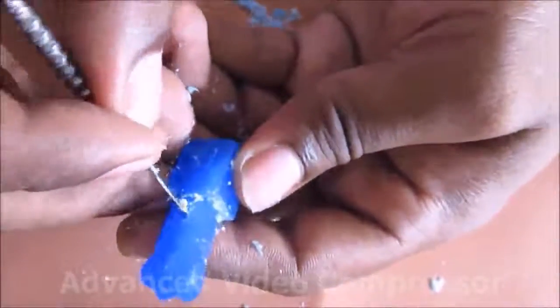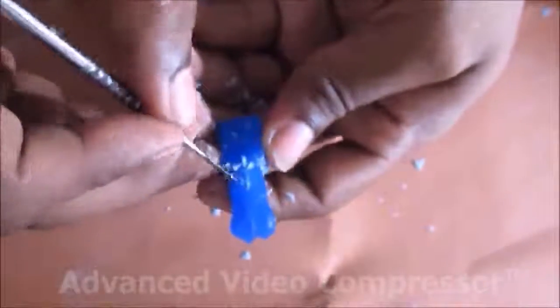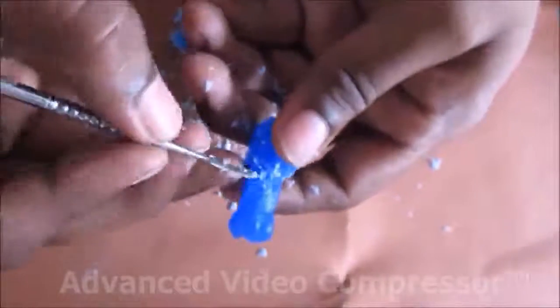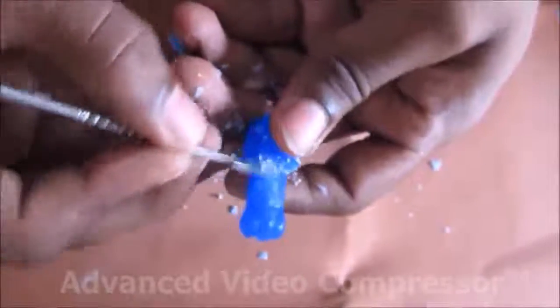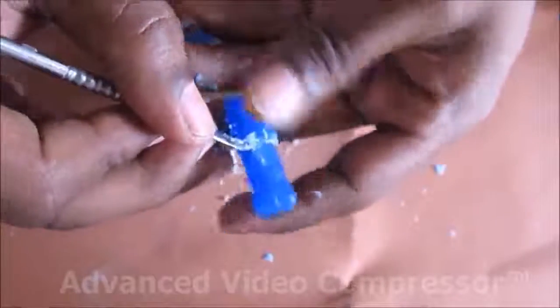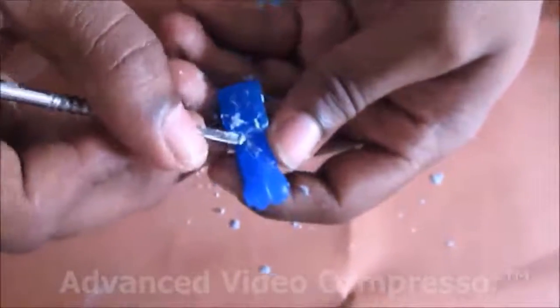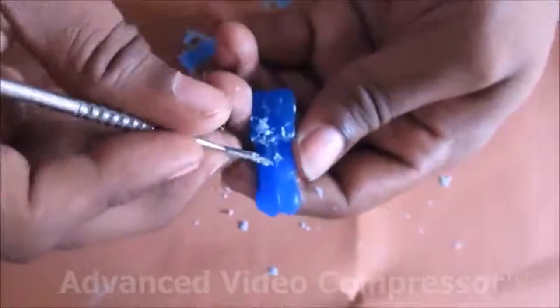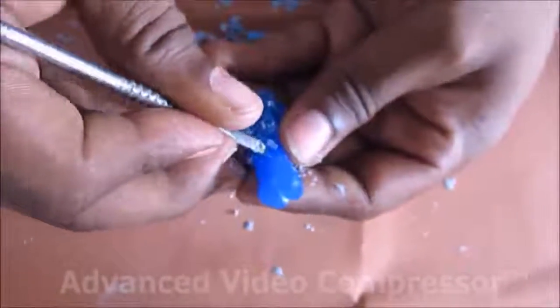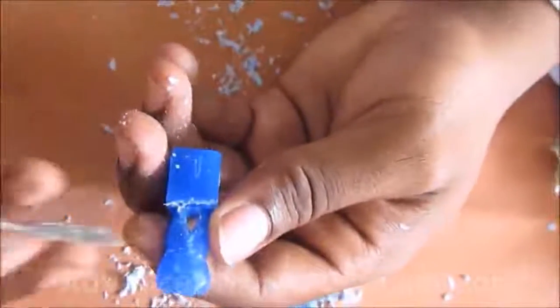Now all I need to do is to make the bifurcation more prominent and then refine the roots. In case the apical third is too thick, carefully remove the wax so as to ensure easy bifurcation of the roots. Here you see me refining the root. Note how I am carefully supporting the wax while I am carving the root.